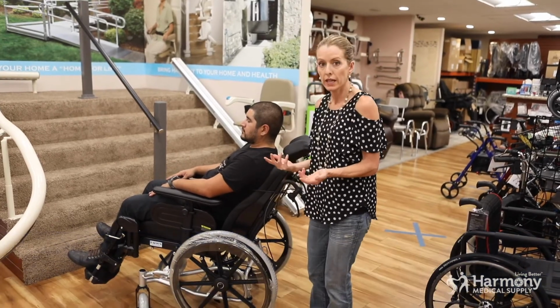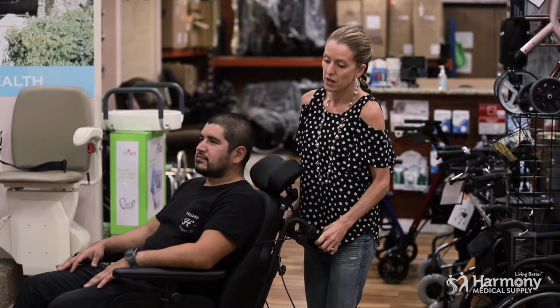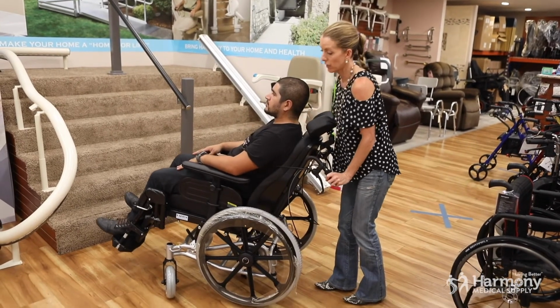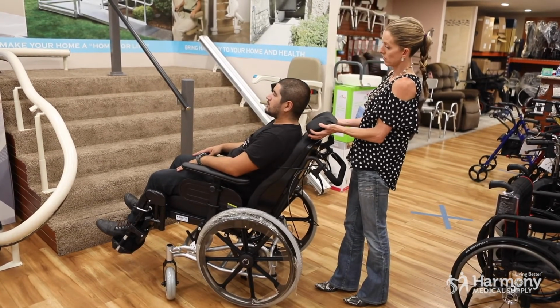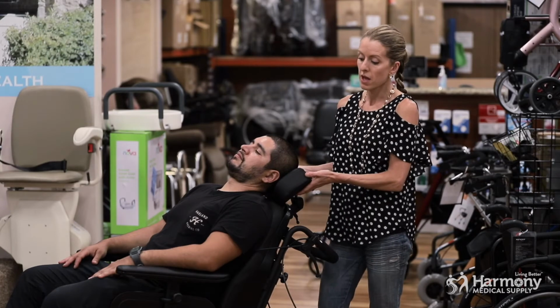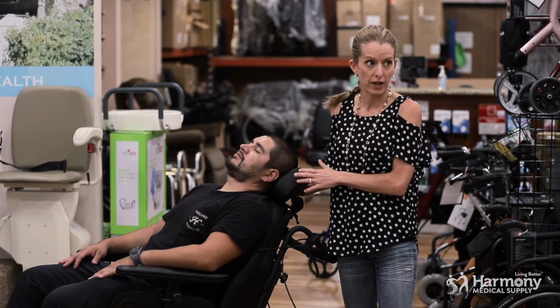So with a reclining chair, you can use the backrest to come back, but then when you add tilt, they don't necessarily have to have their bodies reclined or their line of sight completely up at the ceiling to use that gravity to help pull the head back. So if you put your head back into the headrest, and these are adjustable, you can bring that headrest up to meet their head at any point and support them. You'd be surprised what a difference it makes for our aging population just to know that they have a head support behind them.